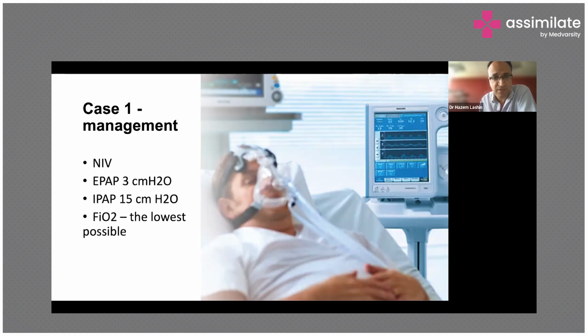in low blood pressure. An IPAP of 15 is a good starting point for this patient to improve their alveolar ventilation and minute volume. In the next instance, you would continue to monitor this patient's blood gases and see what their PCO2 is like and the pH, and you would titrate and increase the IPAP in order to reach a normal or a near normal PCO2.